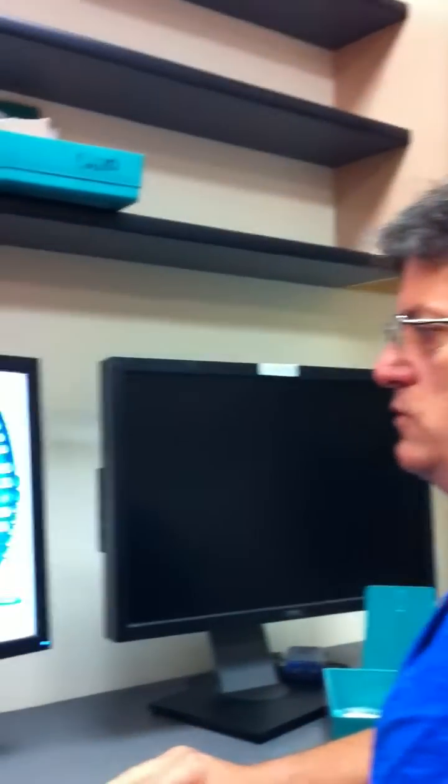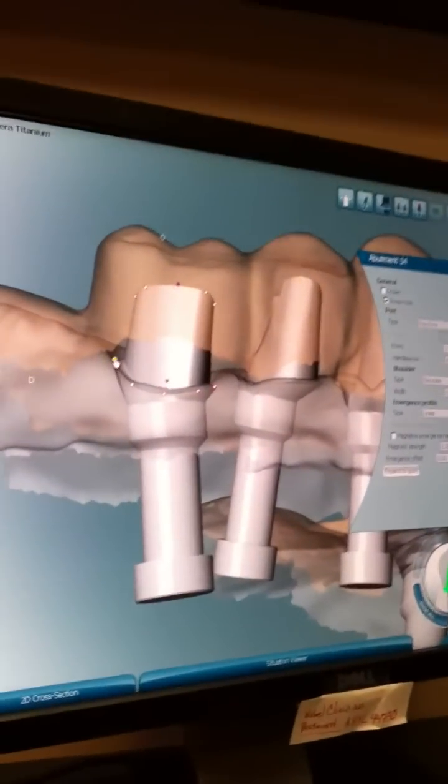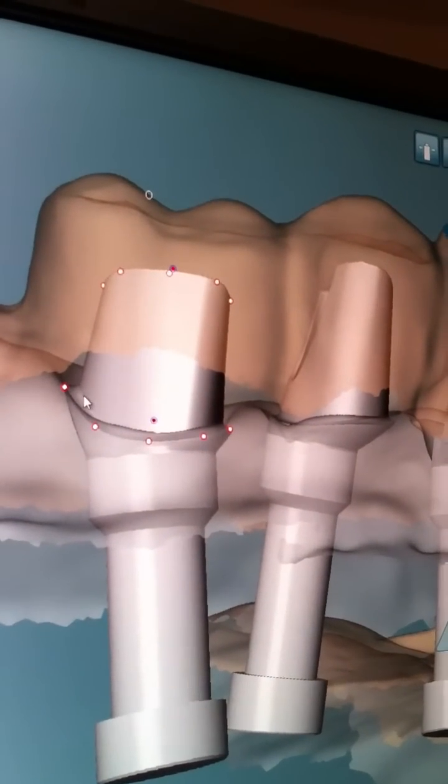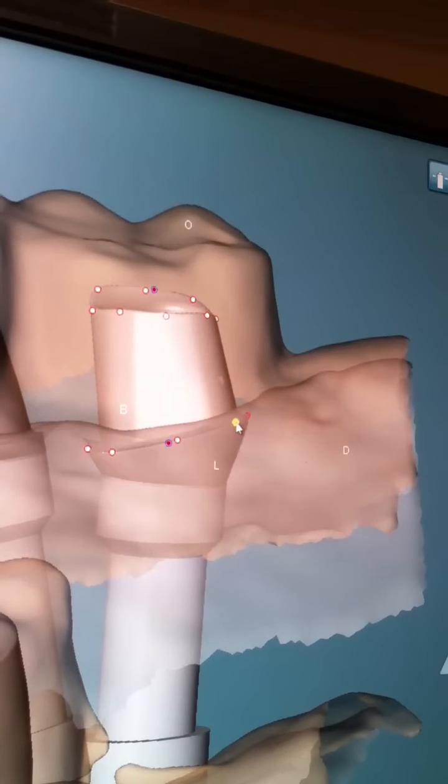So that's generally how we do this. Now over here, I'm trying to match your distal contour from those pieces that you did intraorally to your emergence profile jig that you put together. So I'm just trying to make sure I match what you did.